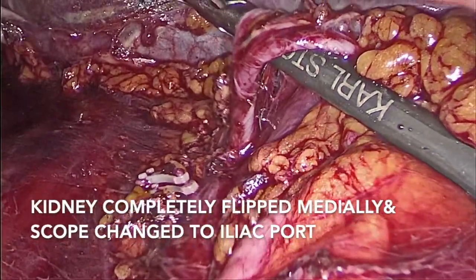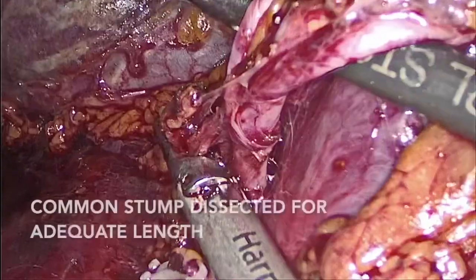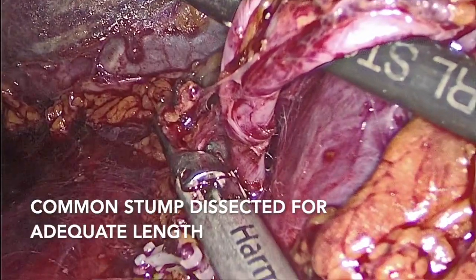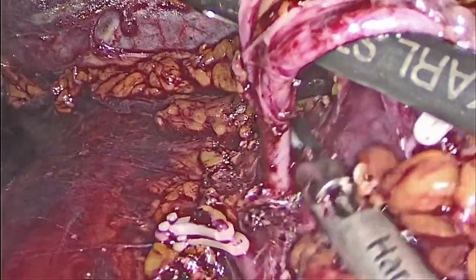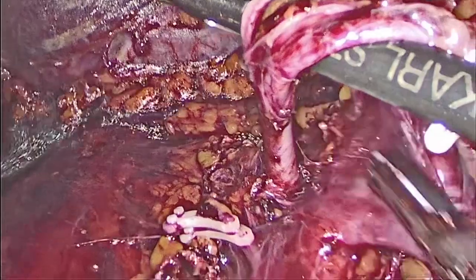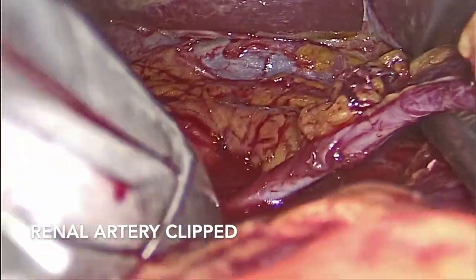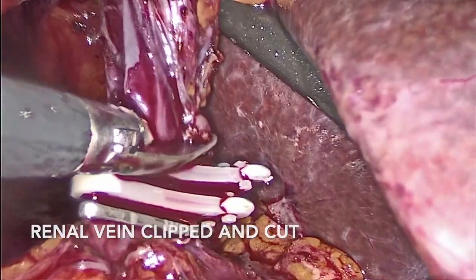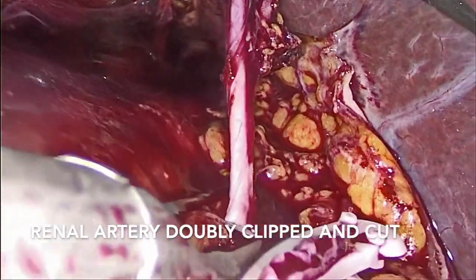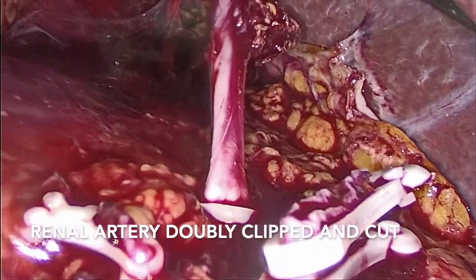Here the kidney is completely flipped medially and the scope was changed to the iliac region port, and further retrocaval dissection is being done to achieve adequate common stump length. This is the final image after completed dissection. Finally, the renal artery is being doubly clipped and cut with adequate common stump.